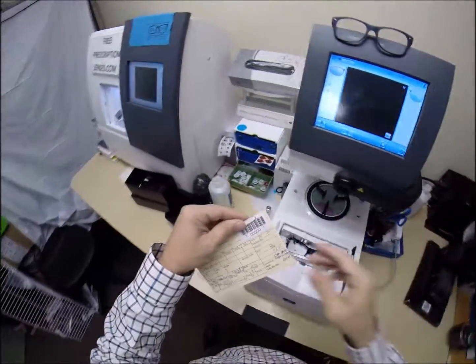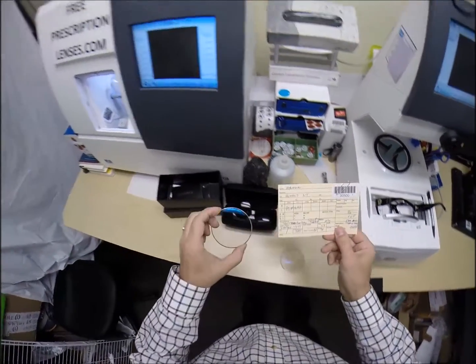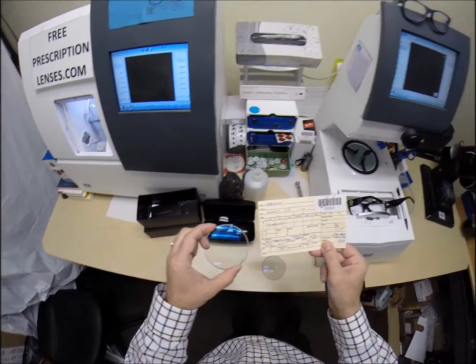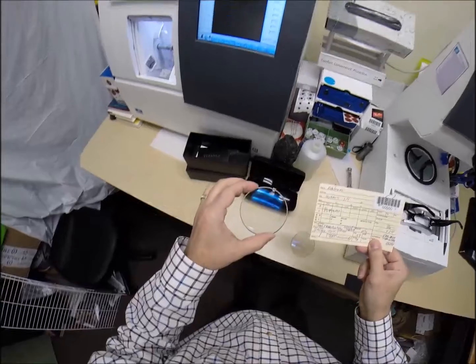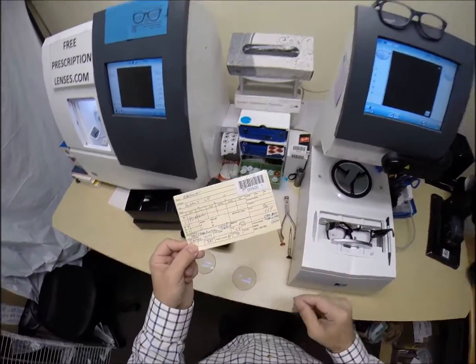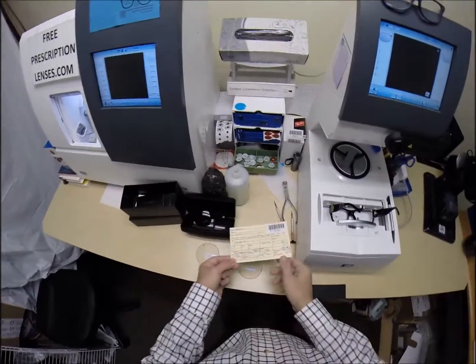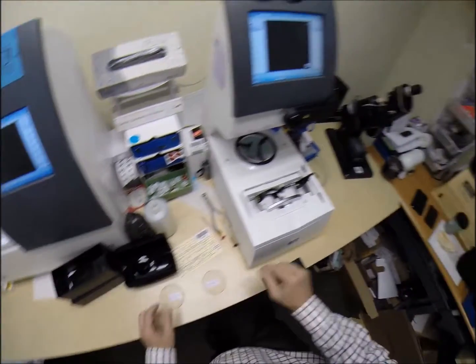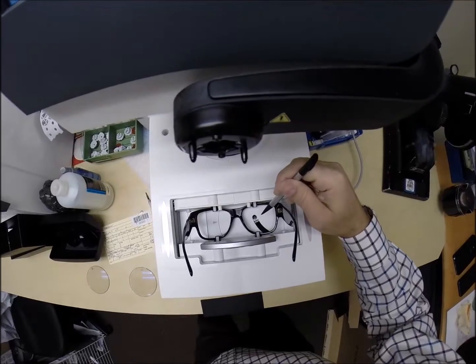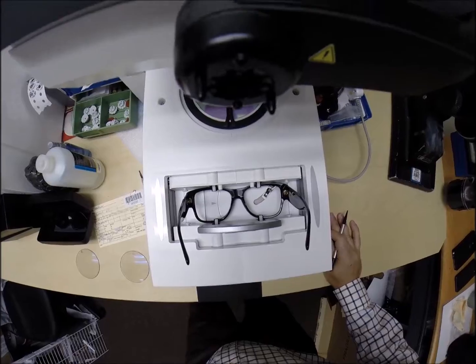There we go. Now, these are non-prescription lenses. Classic case where someone has either some health insurance or unused flex dollars, and they want to get something nice even though they're 20/20. I'm cutting non-prescription Transitions XTRAactive gray with Crizal Sapphire for the Versace frame. But years from now, should you ever need a prescription in these, you are saved as number 500, and I can mail you just the lenses to your home. So let me go ahead and hit start. A little stylus is going to go around. It's going to pop up and trace the inside bevel of the right side of the frame before doing the same thing on the left.